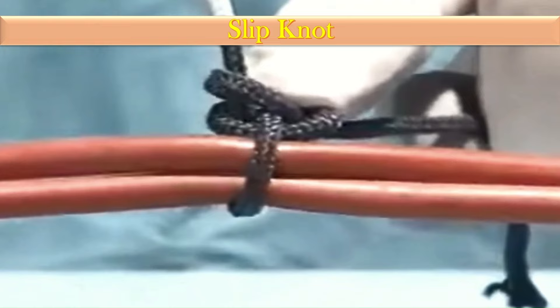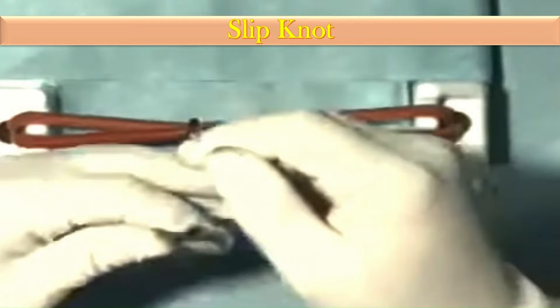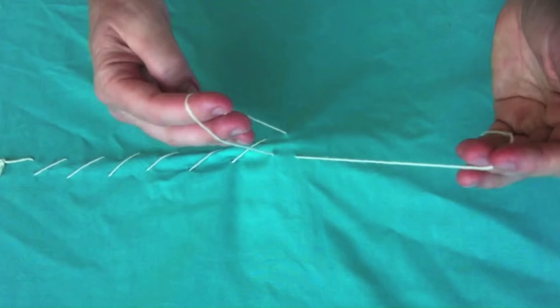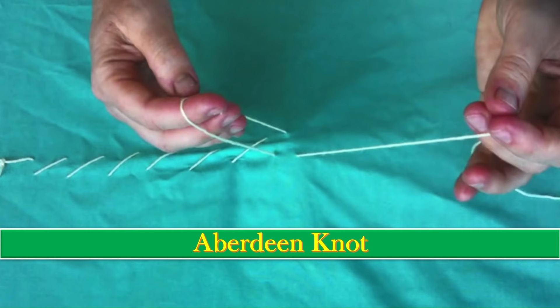Next comes the slip knot. For this type of knot, make a loop by doubling the line back on itself, then run the tag end back toward the loop and lay it over the double line. Make one or two turns with the tag end around the double line and through the new loop created.